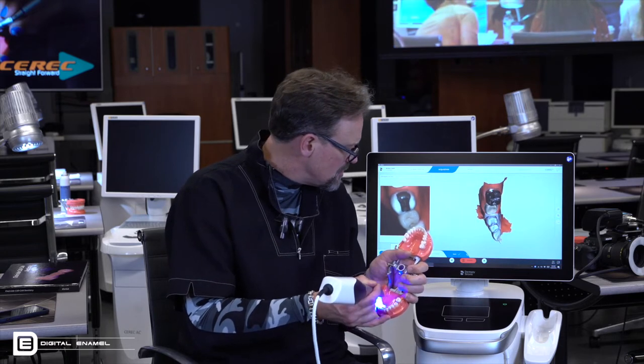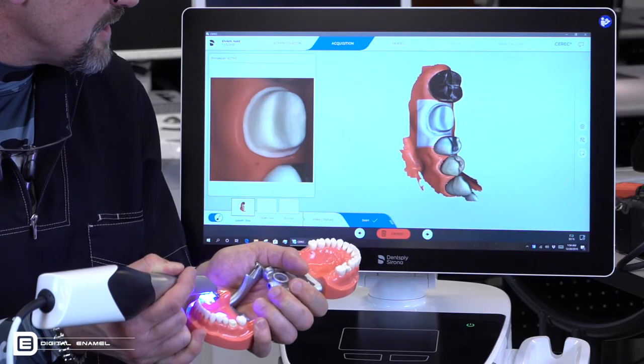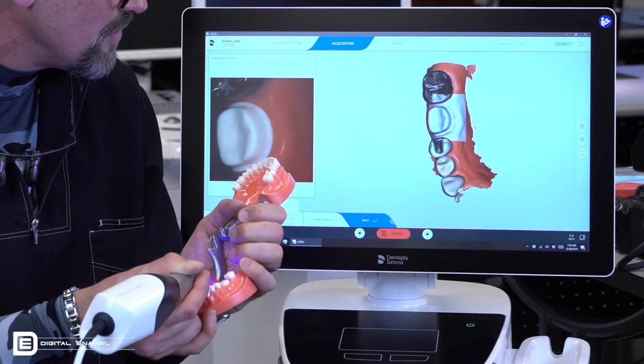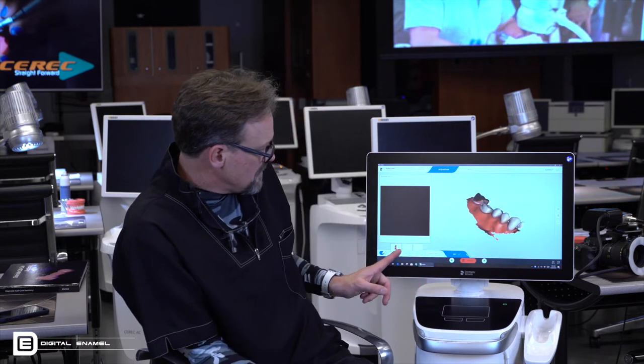So the mistake I see people do is they image it and they image it and they image it more. And then they go back over to the prep and they think, well, I really want my crown to fit, so I want to image more and more. And maybe it needs to see a little bit more on the lingual. And you know what? The data is already good to begin with. If the holes are filled, move to the next step. Move forward.